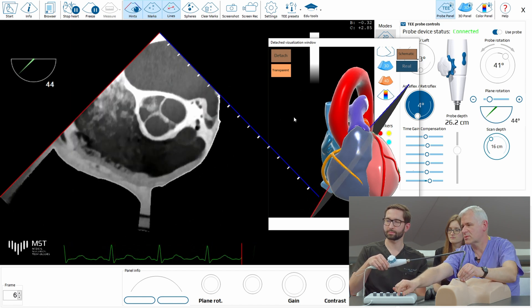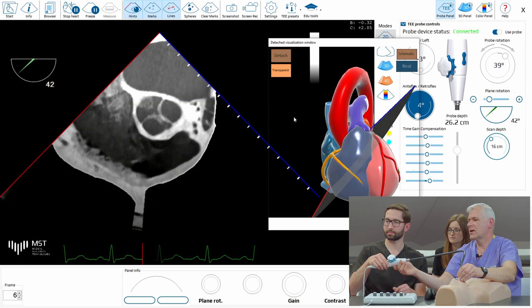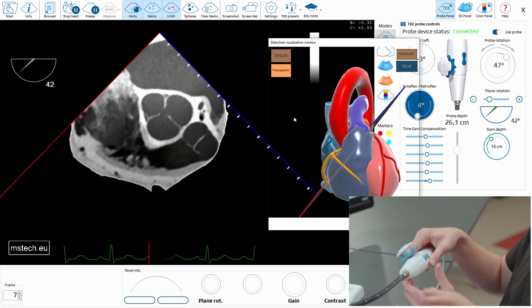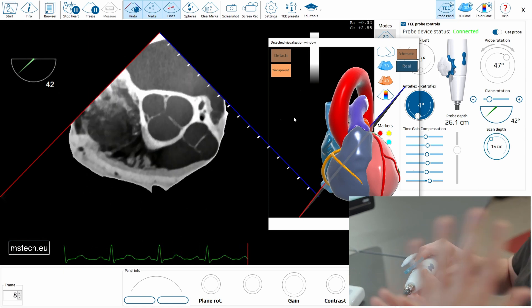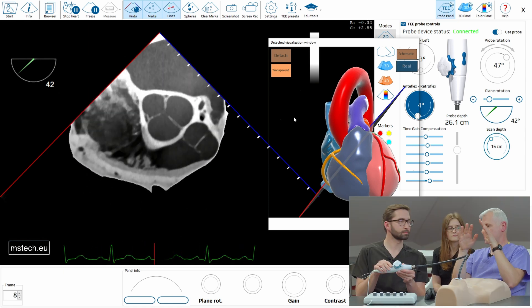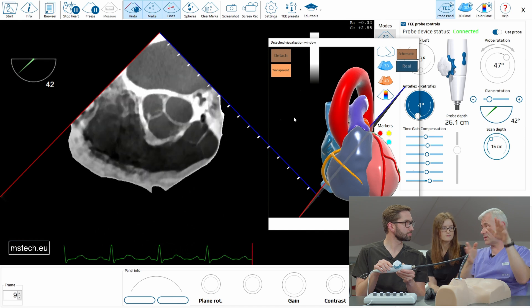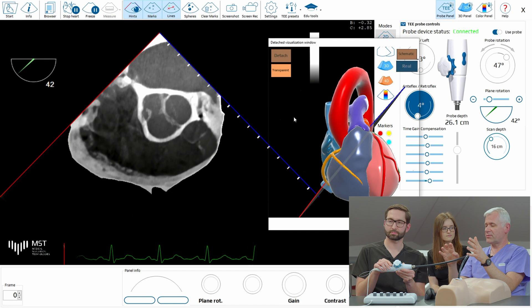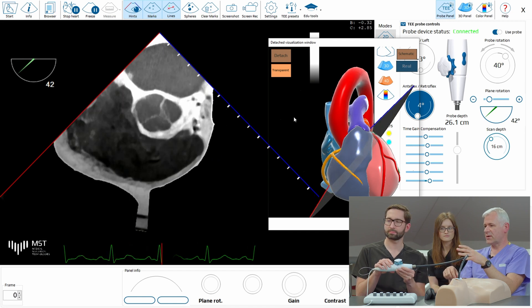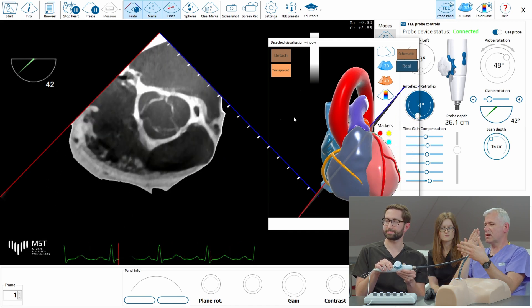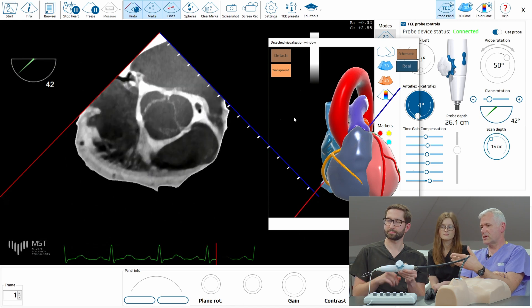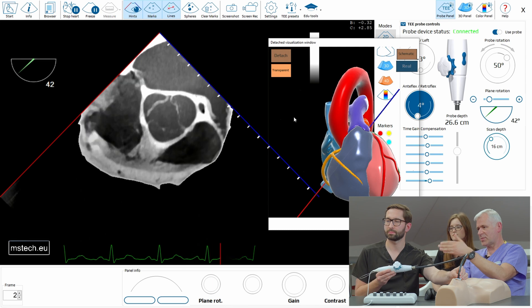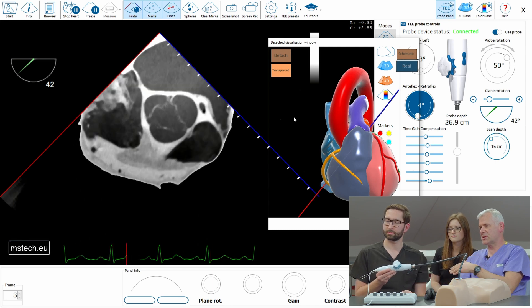Now probably we have to correct slightly. You see that if the plane is not really transverse, each manipulation changes a lot of things. If you have zero degrees, you have full control because you have exactly the same image — you only tilt it. But once you have 40 degrees and you try to rotate the probe, we are changing the level as well, up and down. But if you go to this position step by step, keeping the aorta in the center, you will do it easily.